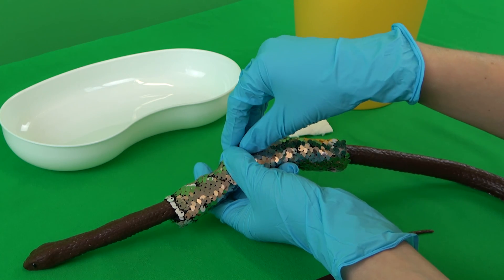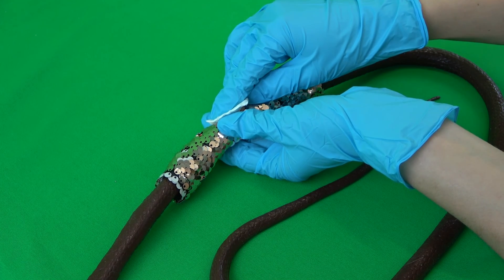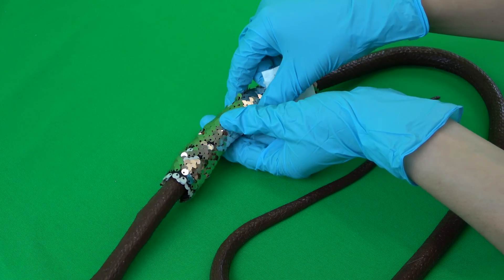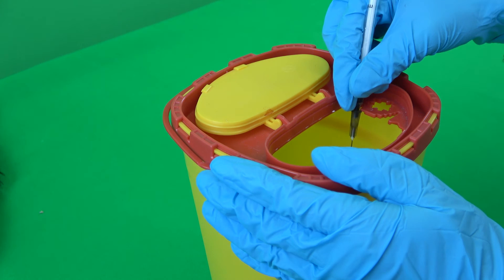Both syringe and cannula are then removed. A light compression with a gauze swab on the puncture site prevents the injection solution from exiting the patient. The cannula is disposed of in the proper container, the syringe in the bin.